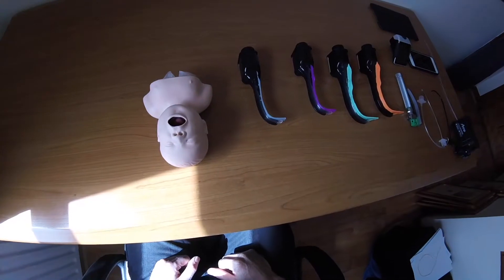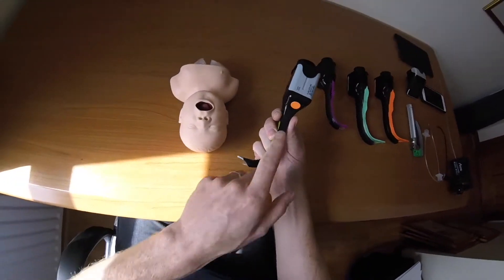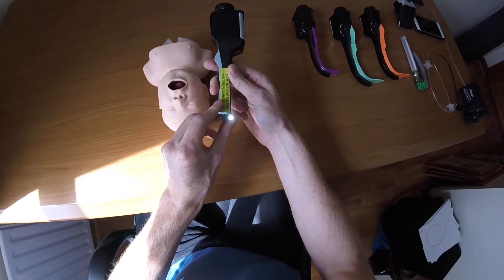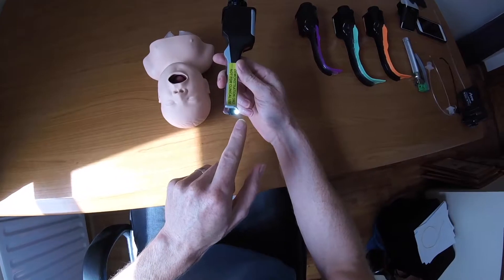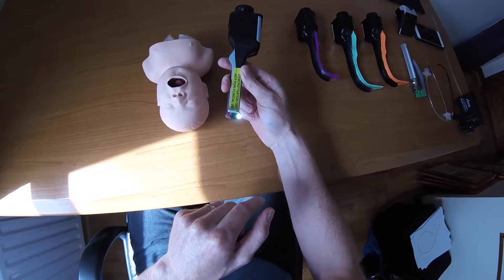We've got the neonatal mannequin, so this is the one I'm going to work on. The first thing you need to do is switch the Airtrack on by pressing this button. The light on the bottom turns on and flashes initially, indicating the Airtrack is warming up. You shouldn't use it until the light stops flashing.